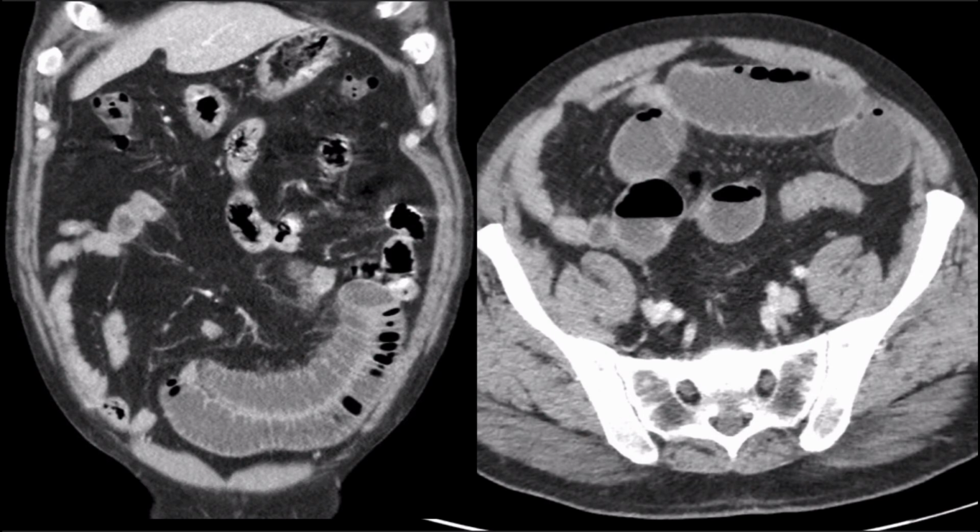To wrap up our case, the radiologist actually called, quite impressed with the indication for the CT scan, especially since the patient had no surgical history and no history of small bowel obstruction. And here's a representative cut of the patient's CT scans. There were no known adhesions, tumor, or any other type of cause for his obstruction. He was admitted to the surgical team, and with just conservative management, he started having return of bowel function and was subsequently discharged home on hospital day 2.